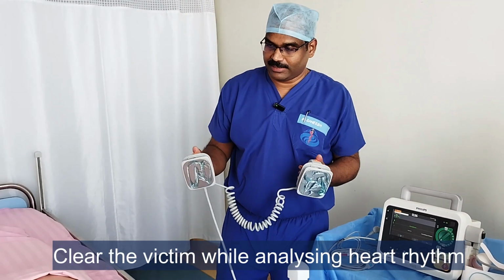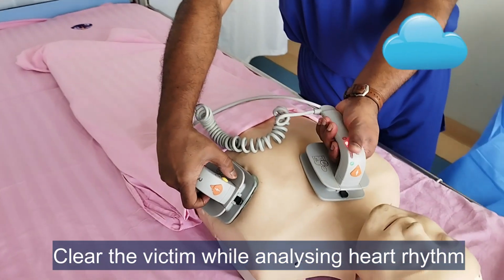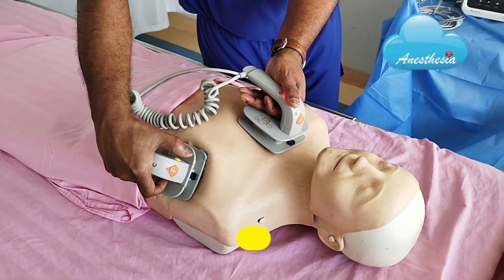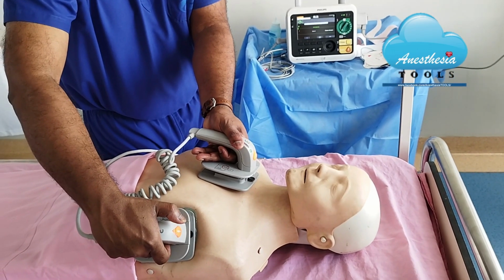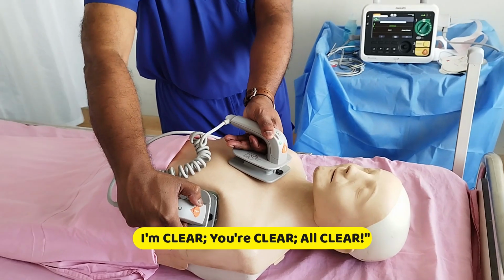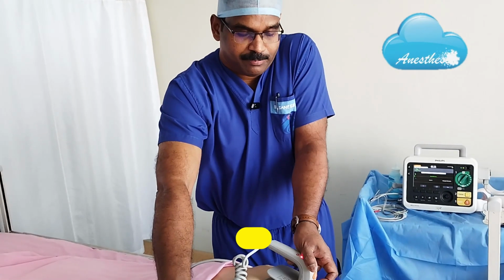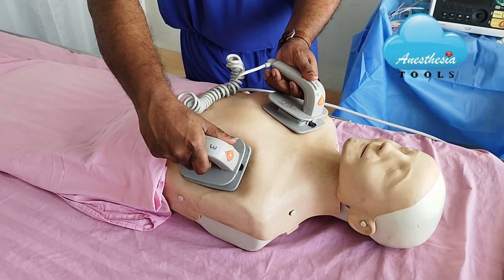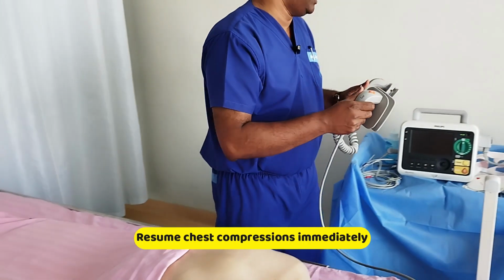So after the chest compression is over, I'll apply the paddles. Okay, I have already dialed the joules. Then I'll charge the machine. Okay, when charging is done, the buttons will start flashing. Then I should announce to the team, I am clear, you are clear, all clear, and then press both these buttons simultaneously to discharge. Immediately after defibrillation, next step is to resume chest compressions.